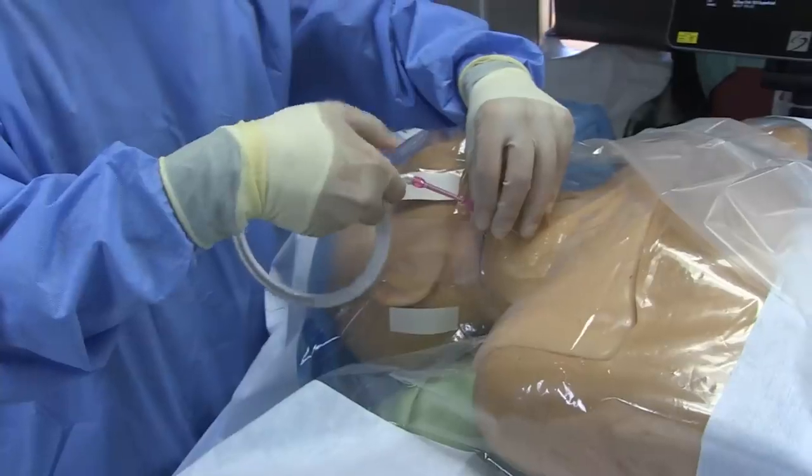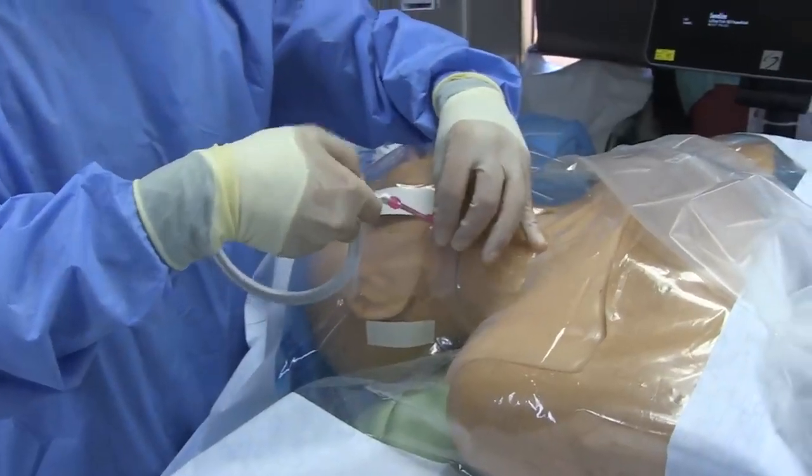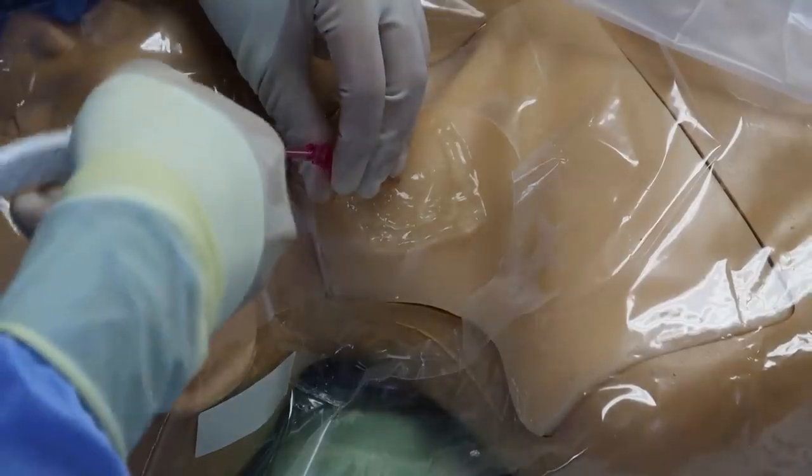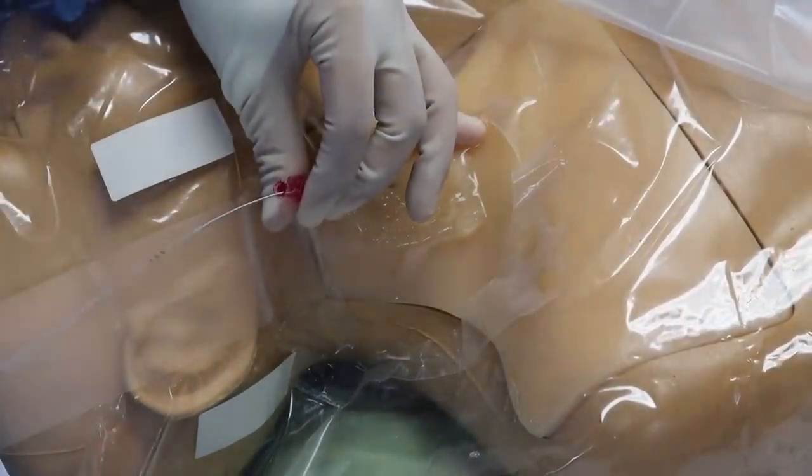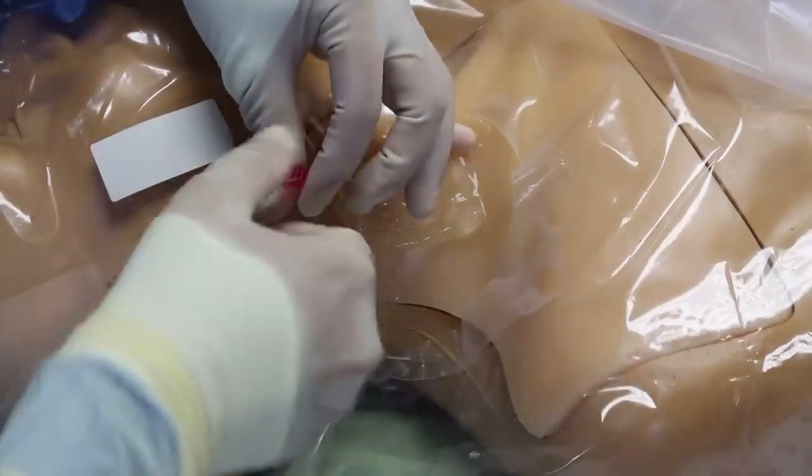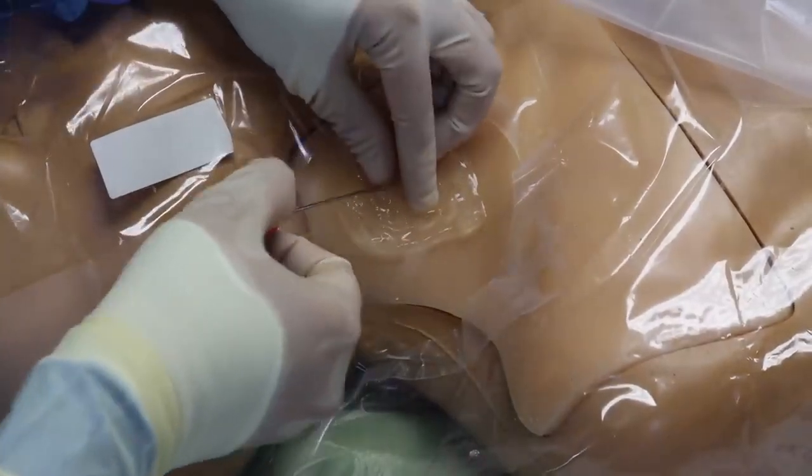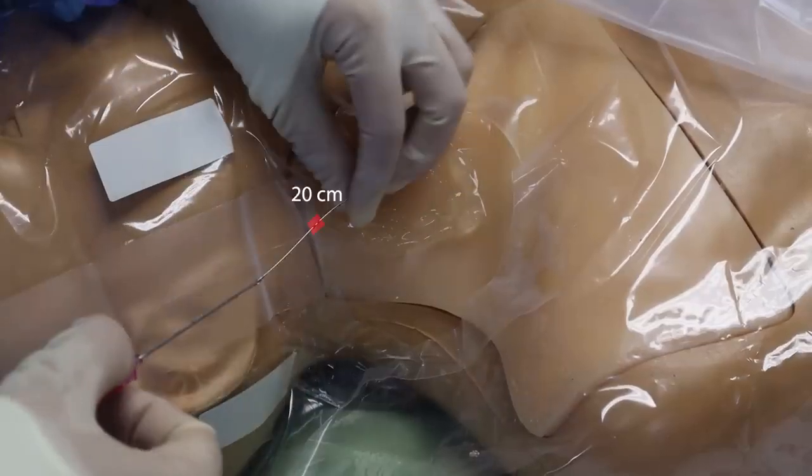Now grab that wire and start feeding it through the needle. The wire should advance fairly smoothly. If it does not, something is wrong. You should stop and reassess. You only need to feed as much wire as the catheter is long. Any more is unnecessary. If your guide wire is like mine, the second or two line marking on the wire identifies 20 cm. And so I advance until that mark is at the skin.